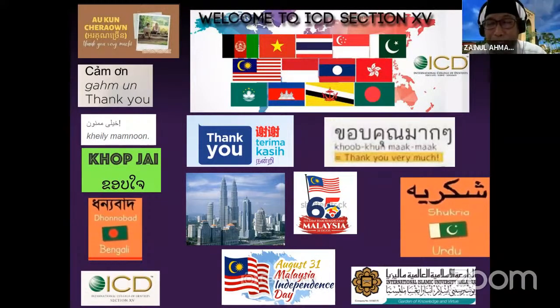The term PSI is a general term. It can be specific for a population, for Malays or for Chinese or Indians. So in other words, it is also personalized medicine, not only surgery but also medicine. For surgery, PSI means that the implant given to the patient will have the right optimum size and be aesthetically acceptable compared to other methods. Other methods don't use 3D software; they are more on 2D.